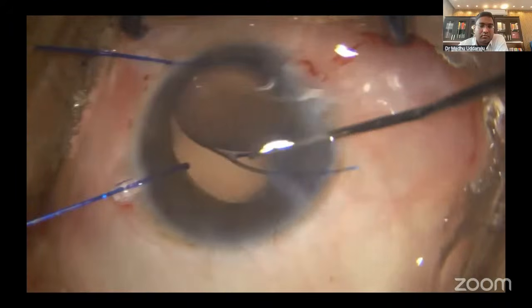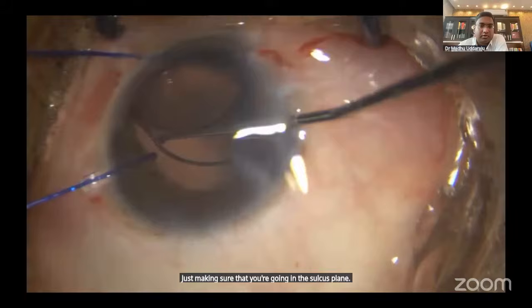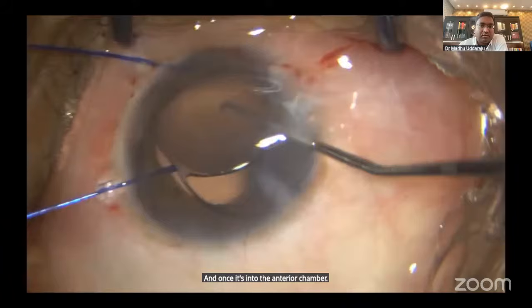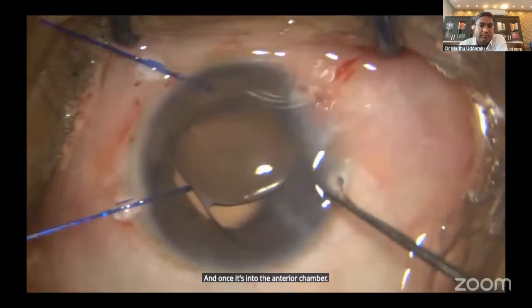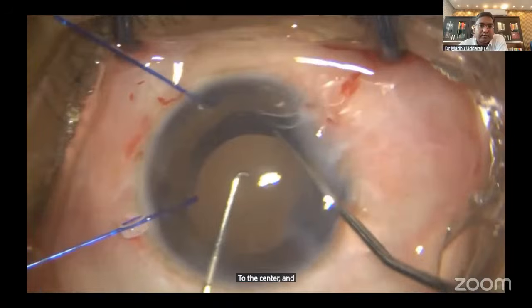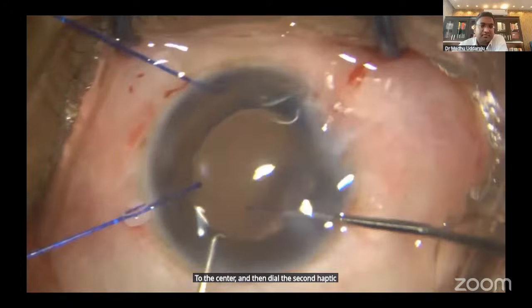Just making sure that you're going in the sulcus plane. And once it's into the anterior chamber, to the center, and then dial the second haptic right under the iris.